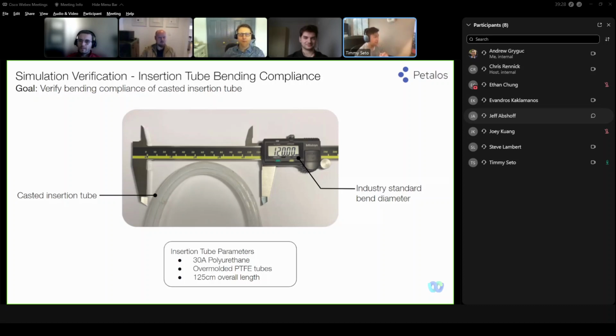But that is actually a feature on traditional endoscopes that they can control. They can control how stiff this meter-long tube is with a dial, and there's a steel cable that basically tensions the entire line as it goes through the body. Are you doing that with internal pressure? No, we don't have that implemented in our device, just for complexity's sake, and it doesn't really impact what we're trying to demonstrate, which is that it's easier to clean. But yeah. All right, thank you.